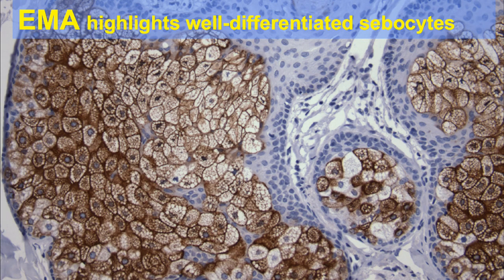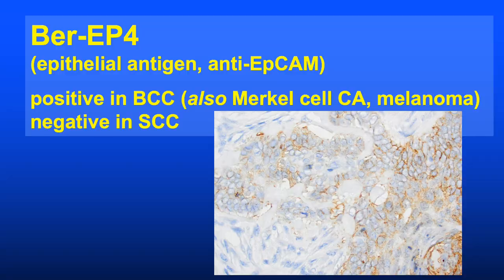Here's a beautiful EMA stain highlighting the well-differentiated sebocytes of a normal sebaceous gland. BerEP4, also known as epithelial antigen—an anti-epithelial cell adhesion molecule antibody—is particularly useful in DermPath because it is positive in basal cell carcinoma and negative in squamous cell carcinoma. This membrane staining pattern is typical for BerEP4 immunopositivity in basal cell carcinoma.